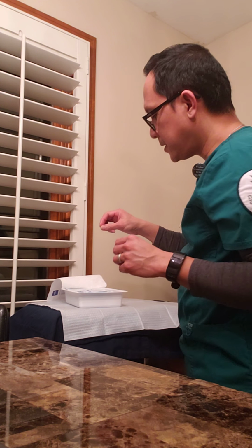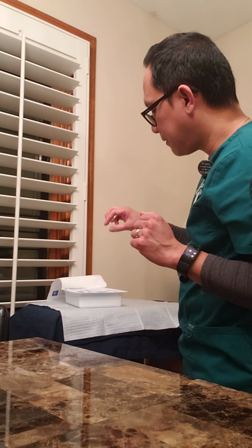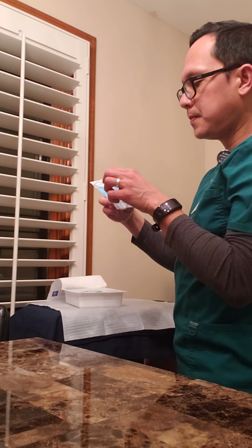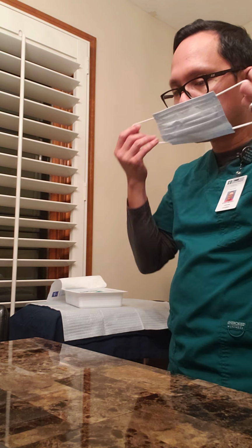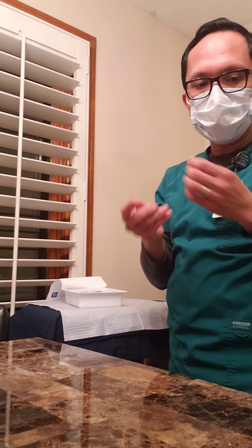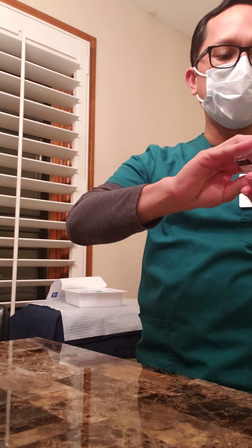Once it's open, I'm going to carefully take out the mask that I'm going to be using. After that, I'm going to perform hand hygiene again, and I'm going to put on some regular gloves.